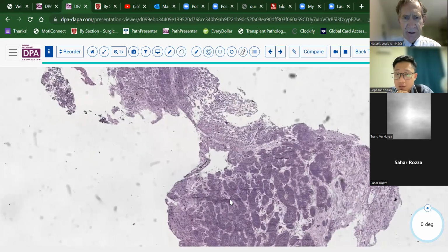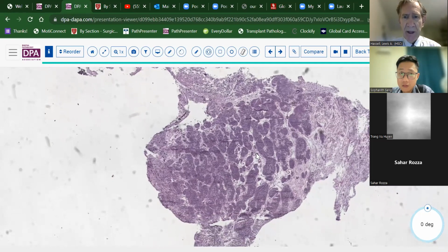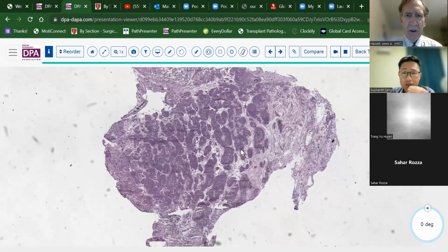Now this is, as you can see, the stain here is a little different than the earlier slide. And that's a consideration also, in that sometimes, because frozen section staining procedures are not always standardized, you'll get variations in staining character from day to day, or certainly from location to location. But this is a much more blue stain than an eosinophilic stain. So we either didn't spend as much time in the eosin, or there just isn't as much eosin in this particular case.